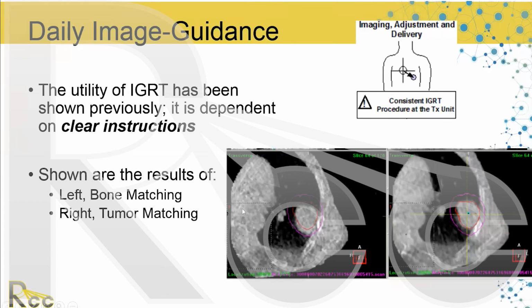And that's again, what are you aligning to? Are you aligning to the rib? Are you aligning to the soft tissue? What you might be most concerned about in this case is rib toxicity. So maybe that's what you want to have consistency in, what you predicted to be your rib tolerance. Or maybe, because you see here, this one's still encompassed in the PTV, in the expansion, but we want to make sure that whatever it is that we're focused on is clear, and that the physician has outlined this properly.